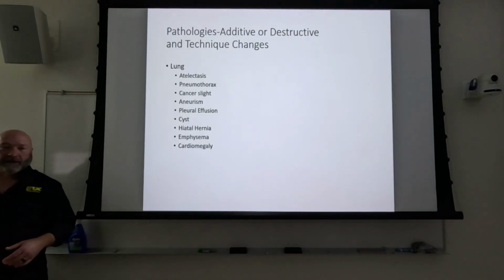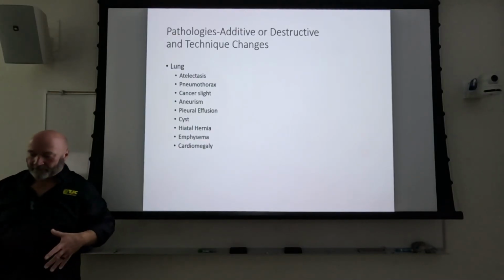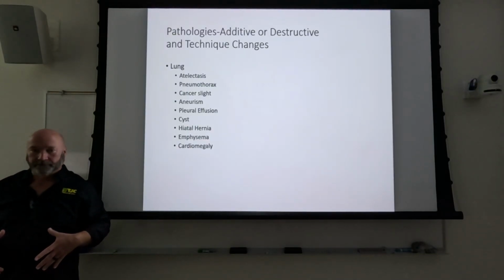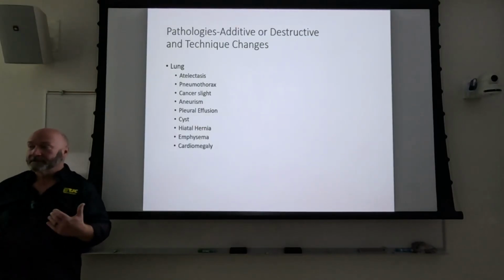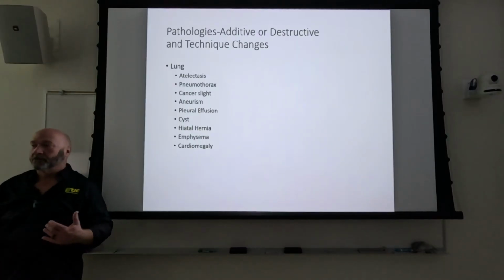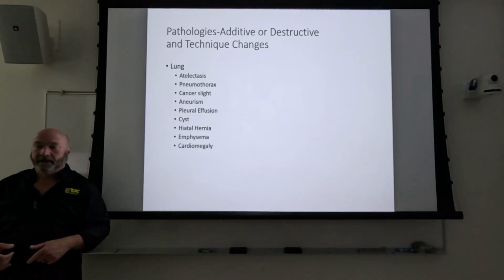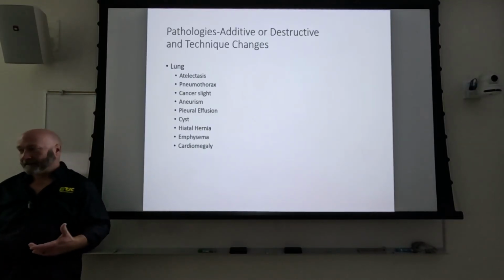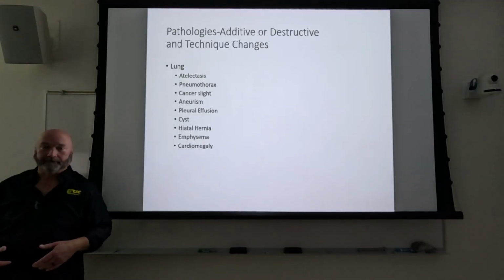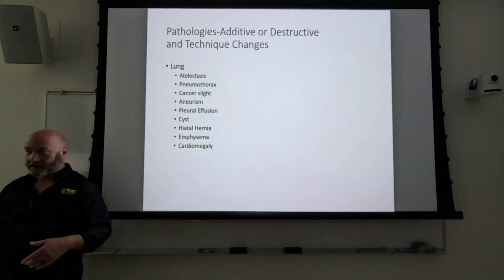And in this case, we shot the scout before we were doing an IVP on the patient, and you've got the spine, and then we saw a bulge on either side of the spine. And it's like, okay, don't inject this patient. It was when I was still a clinical instructor at ETMC. Don't inject this patient, don't move this patient. I want you to go back and show this to the radiologist. I was like, this can't be what I think it is. And sure enough, it was a AAA. That guy was on the operating room table at the other hospital the next morning.